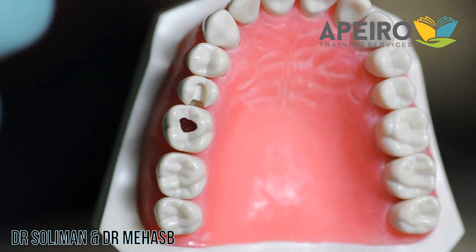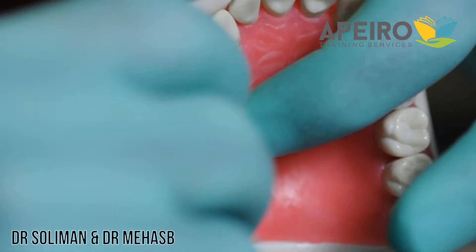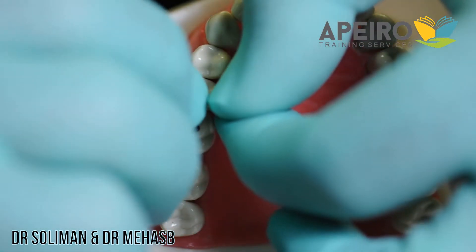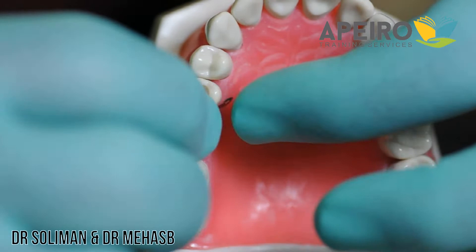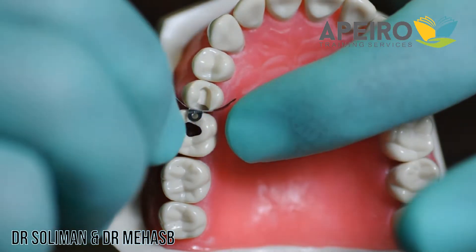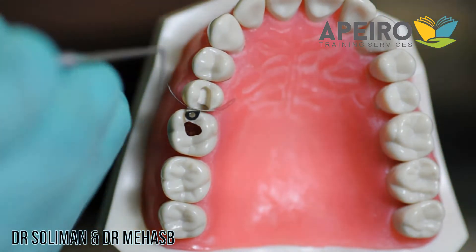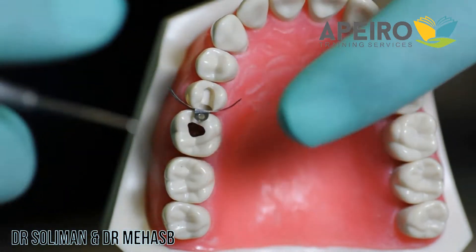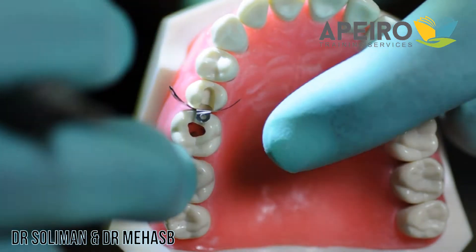We'll show you how to put the sectional matrix system — first put the band, and you need to make sure that the contact is cleared in both buccal, lingual, and gingival. After putting the band, try to adjust it so the middle of the band will be on the marginal ridge of the adjacent tooth.